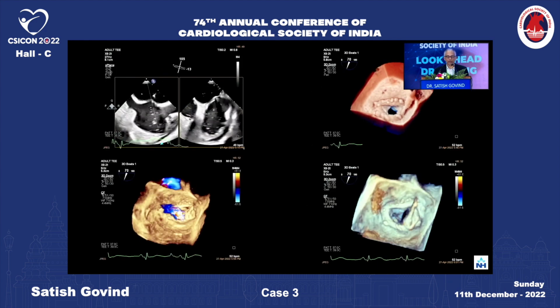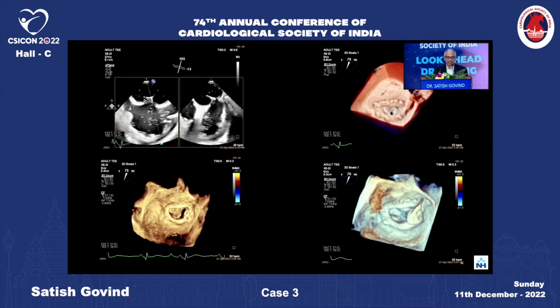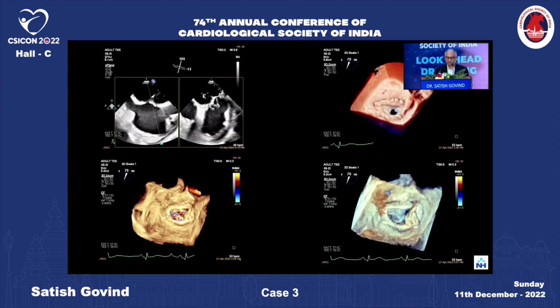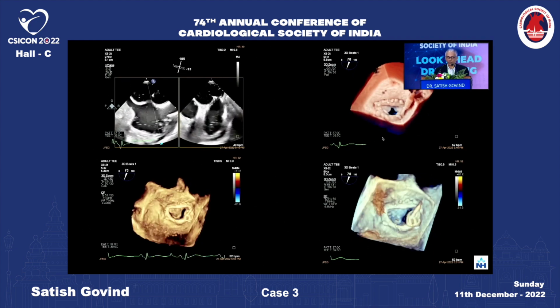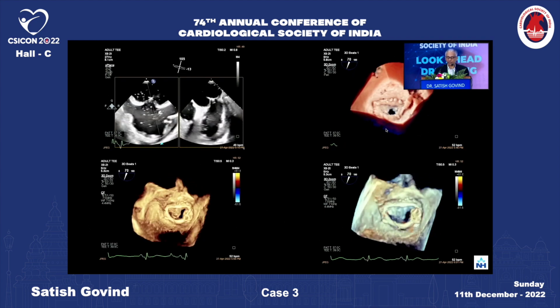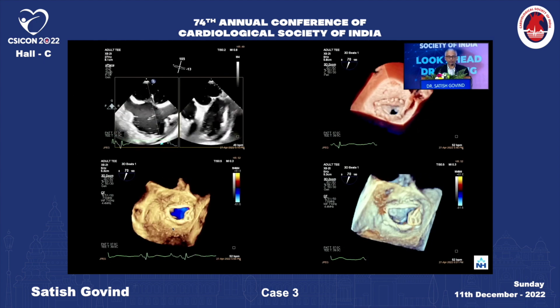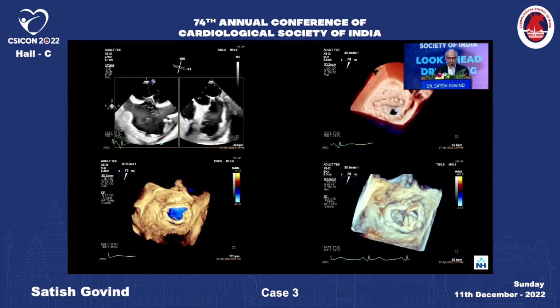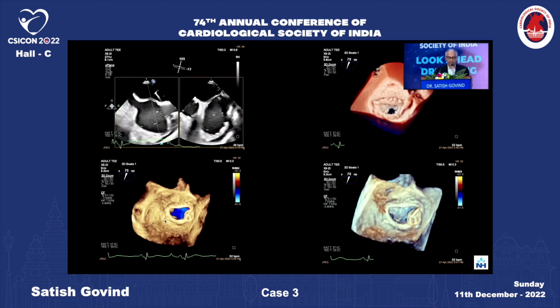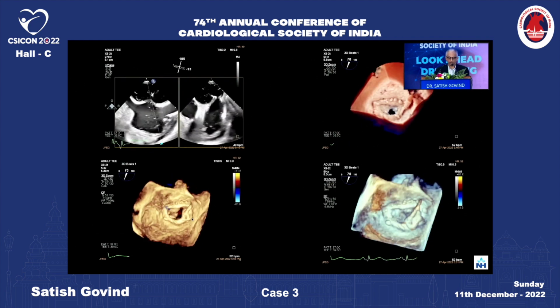And the septal puncture was done. We went a little high, because it was a medial leak, which we wanted a little height. And the defect was wired relatively easily, so it went through quite quickly. And here you can see the device being put in place. So this was an AVP2 plug, and you can see that after the plug is put in, you don't see the regurgitation happening. So the leak has stopped here.